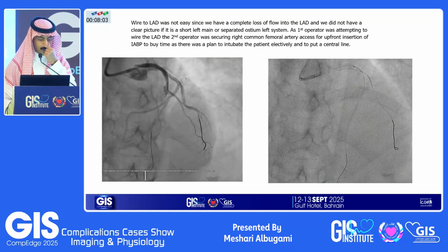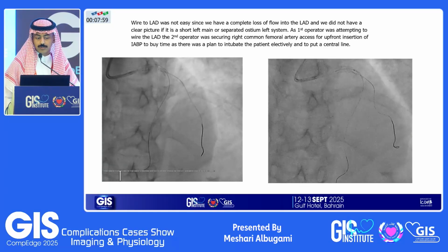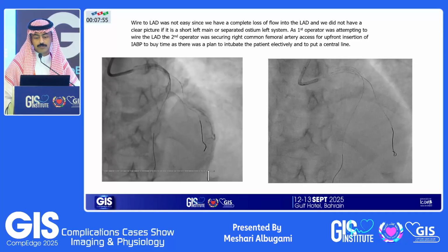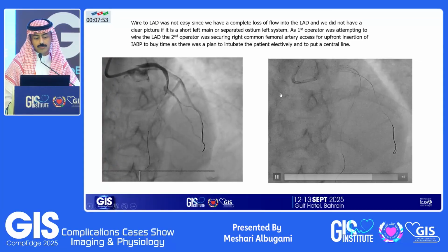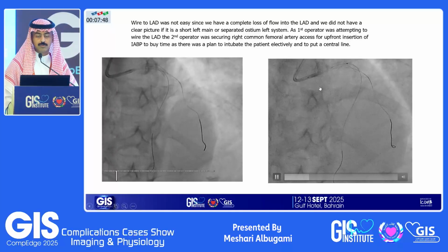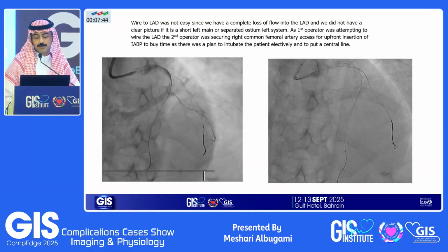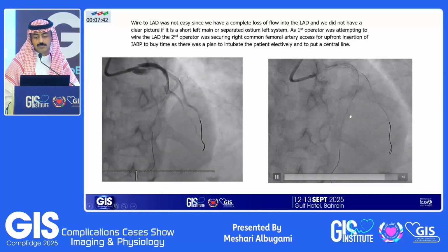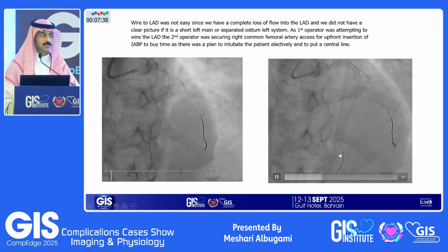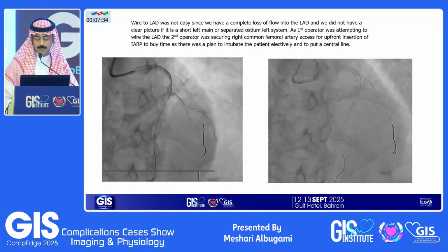Fortunately, we managed to wire through the LAD, and we found the true lumen, and we stented proximally with restoration of almost 70% of flow to the LAD. But at that point, the patient's blood pressure started to go down, which led the second operator inside the room to use right femoral access to insert an intra-aortic balloon to stabilize the situation and buy us some time to proceed with our intervention.